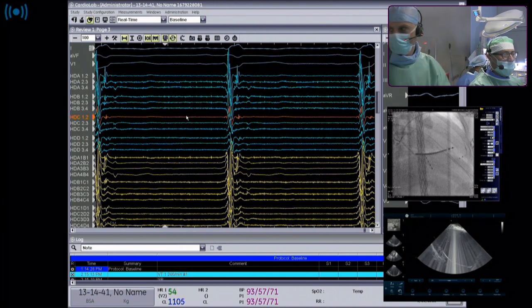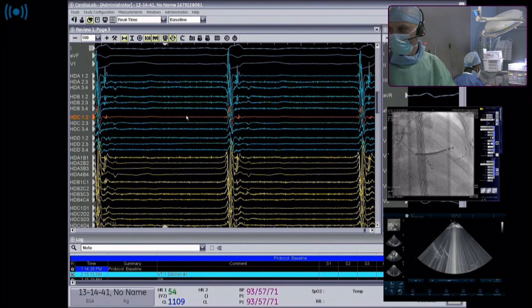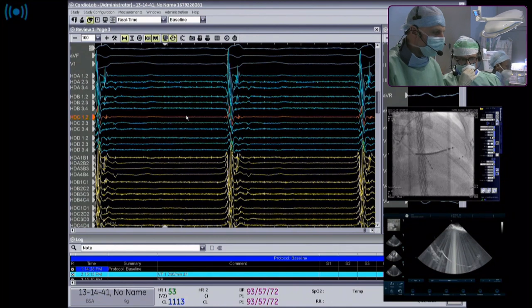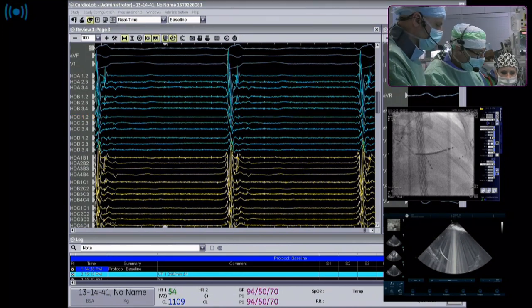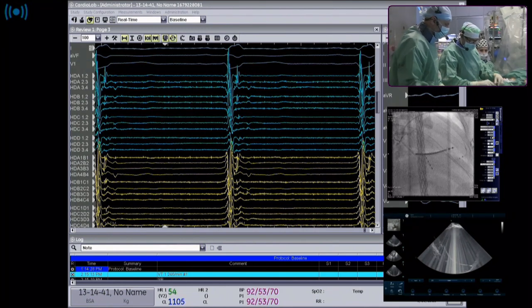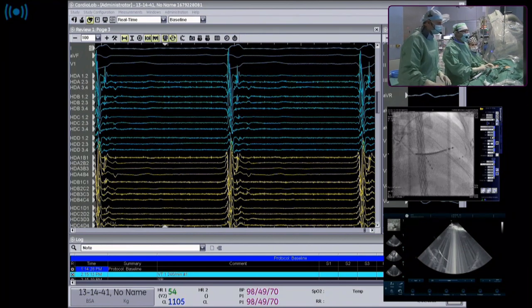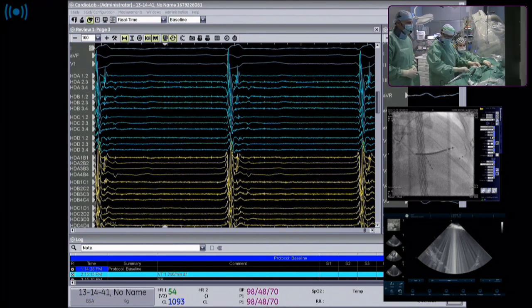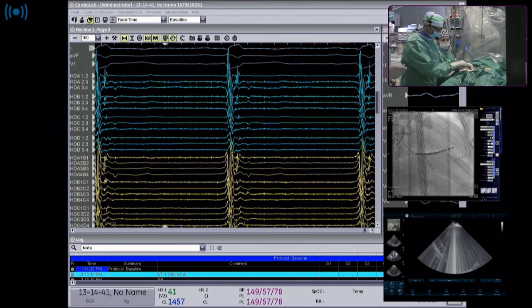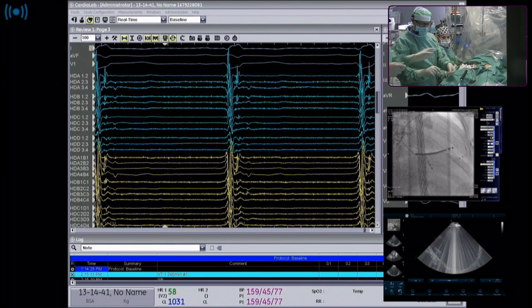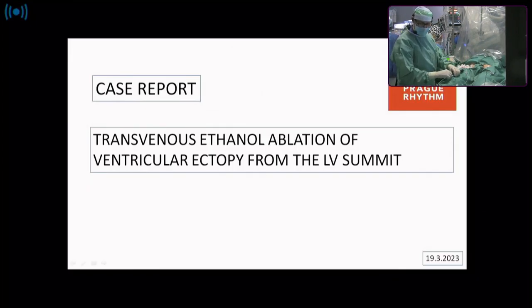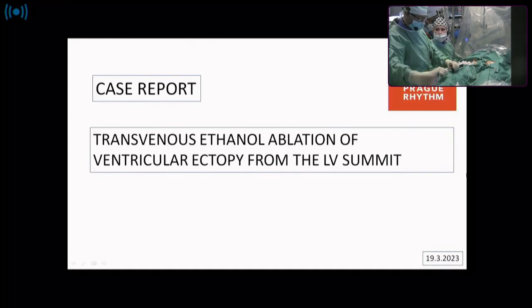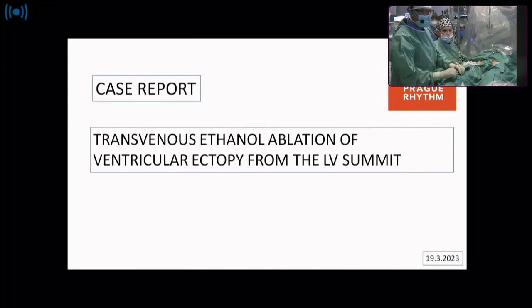There are no more questions from the auditorium. We'll start ablating now and then you can switch to another lab since it will take some time. I'll go transseptal preferentially. Just restart the first application to see the electrograms and then you can switch to another lab - there will be a lot of ablations to do.